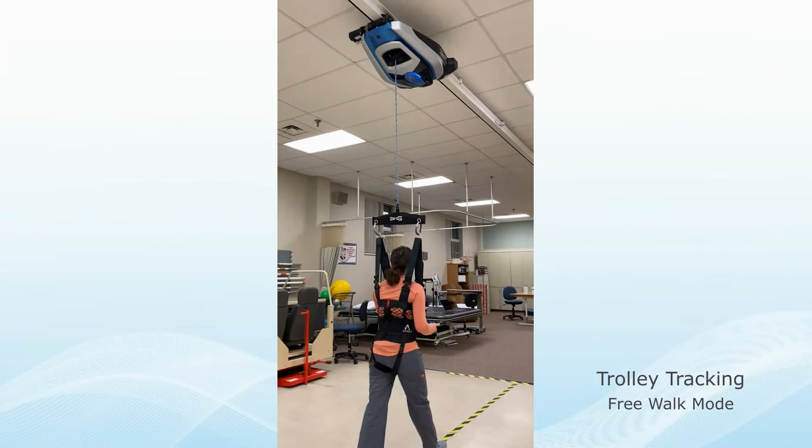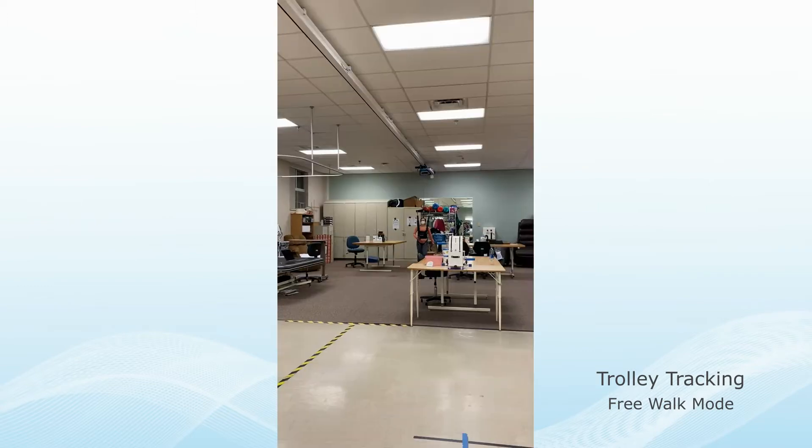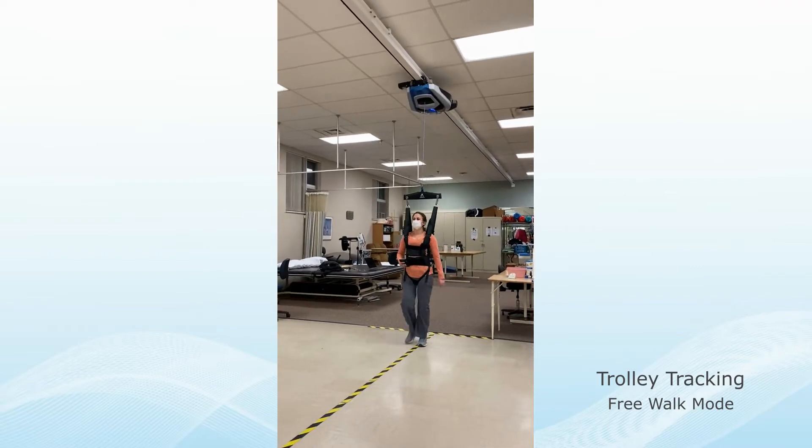Trolley Tracking determines how the robot moves with the subject. There are various types. For most applications, free walk is used, which allows the subject to move along the track naturally.